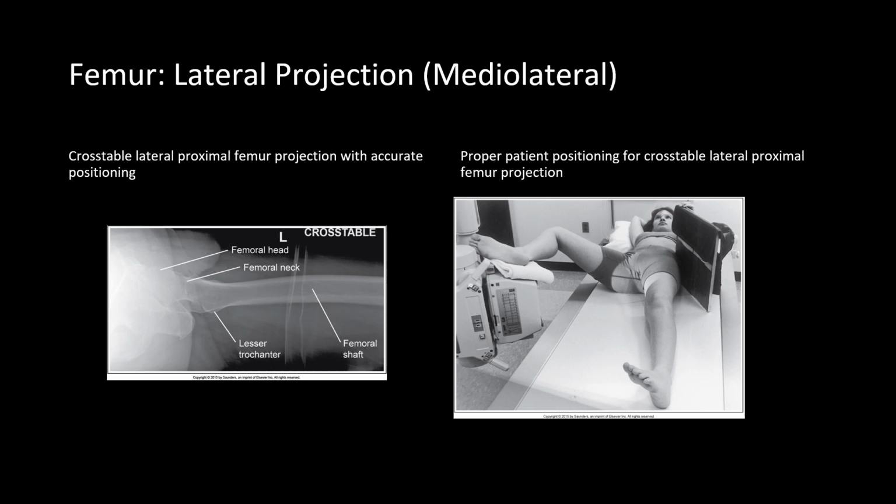We know for patients with suspected or known fracture, we won't be moving or rotating that leg. So therefore, it requires a cross-table lateral or axiolateral projection. I'm just demonstrating here accurate positioning for that projection. However, we will cover radiographic image analysis guidelines in the hip and pelvis section of the presentations.